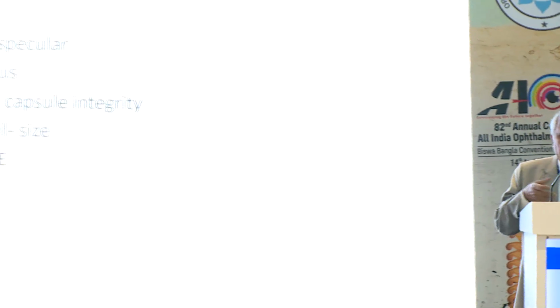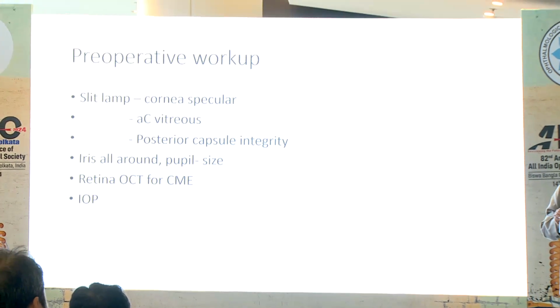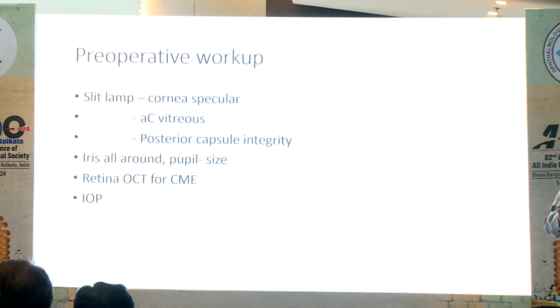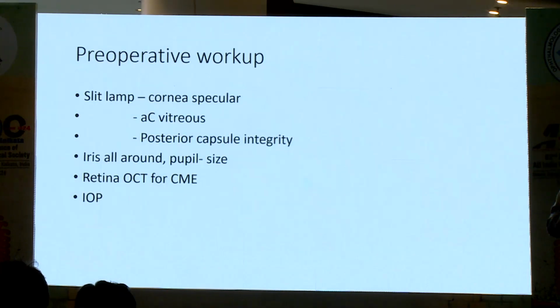And now a little bit about secondary IOLs I would like to discuss. There are several techniques that can be adapted. What you have to see first is that you can either implant it on the table when you have a complication, or you can do a secondary IOL later. After the surgery has been done, you find aphakia, and as Shivangi has shown, if there is dislocation of the IOL or dislocation of the lens, you can do a very good iris claw lens, which is retropupillary fixated. That is very, very important to learn. It takes no time, and the surgery remains very quiet postoperatively.